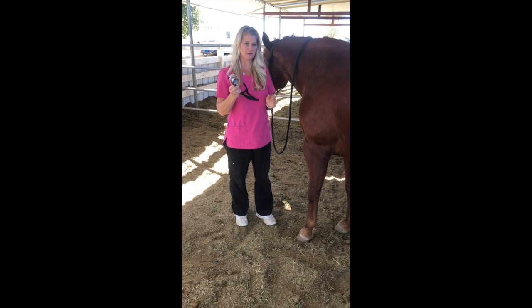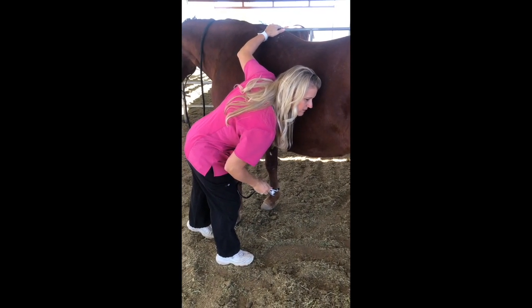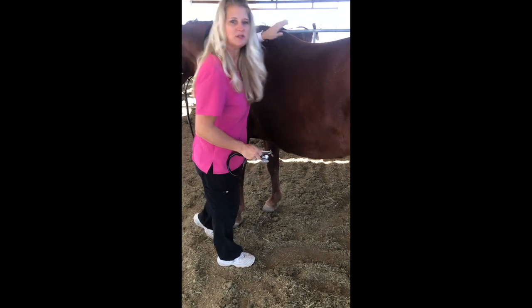Another thing, if you don't have your stethoscope, you can just simply listen with your ear. And I can hear all kinds of gurgling going on in there. So she's healthy.